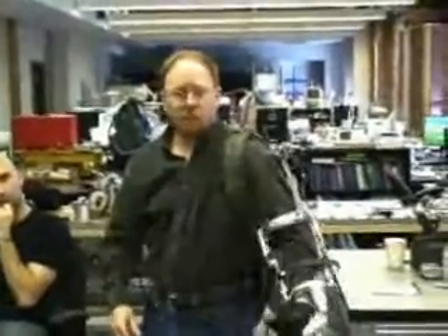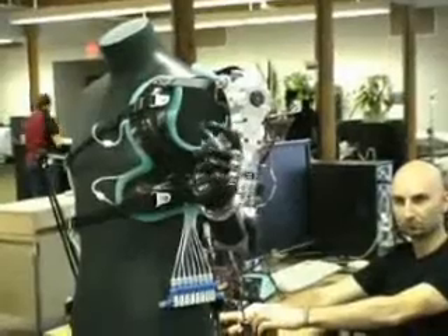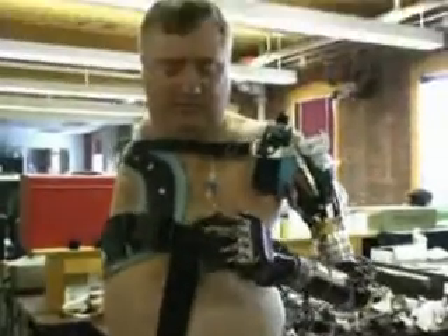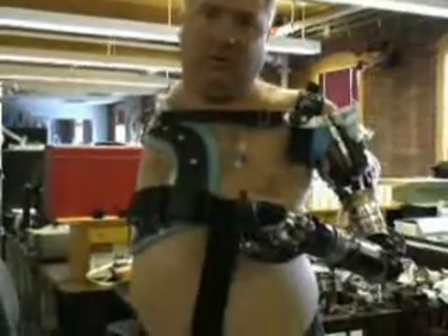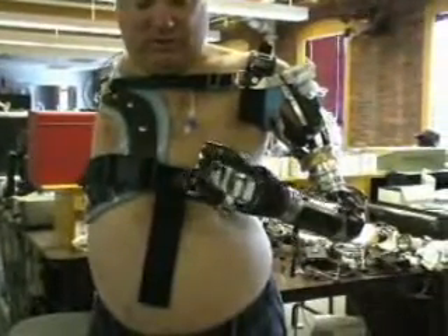The electronics support a variety of inputs. Depending on the user, the arm can be controlled by nerves, muscles, or even foot pedals. How cool. And if I push on my little toe, it goes down. And then I have a muscle site up here — I switch with my muscles. So now, when I push on the ball of my foot, it rotates the wrist. Push on the outside, it rotates in.